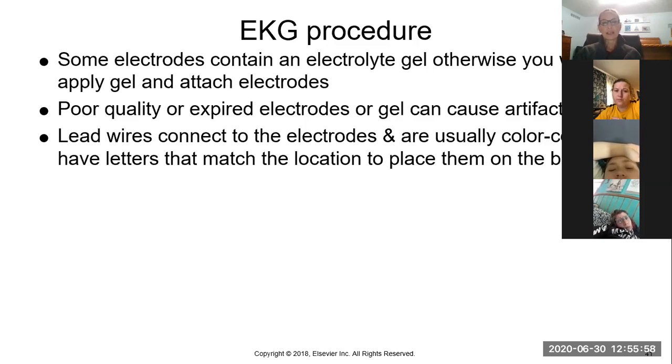Lead wires connect to the electrodes and are usually color-coded and have letters that match the location to place them on the body. So even though we have to learn where things go, most of these machines these days will direct you to where to put things, okay?